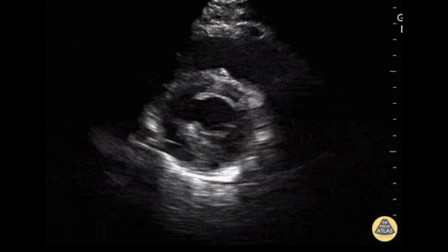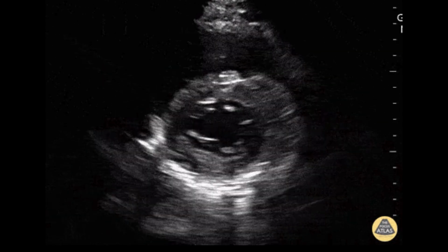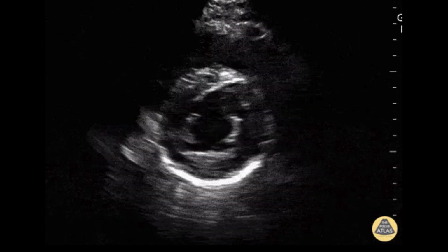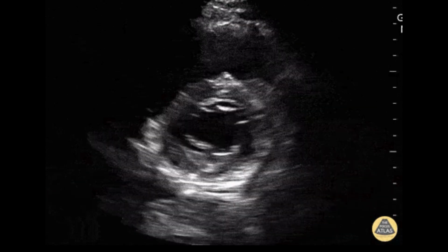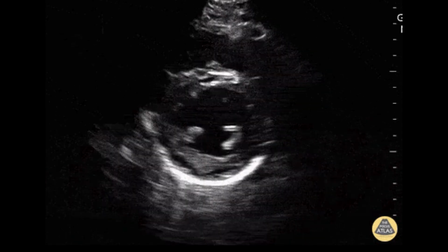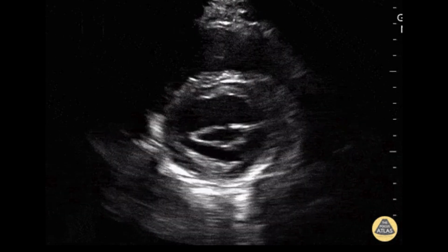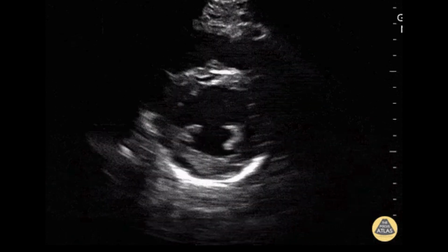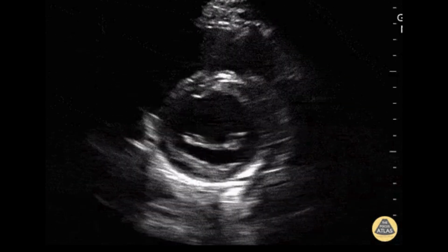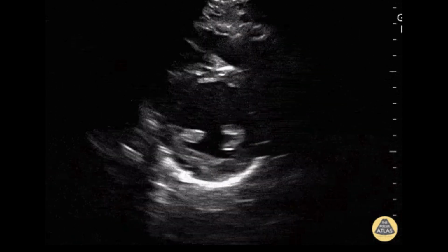And then obviously, if it's not nice and round, then you need to figure out why the LV is not nice and round. So if there's a flattening of that septum over there, then that means that the RV's got pressure overload and it's pushing on the LV. So you need to think why that is. Did you give too much fluids? Is this a PE or is this chronic pulmonary hypertension from COPD or whatever? So that you need to figure out.